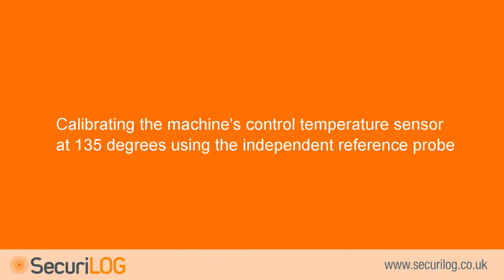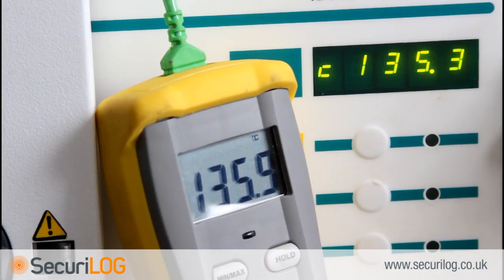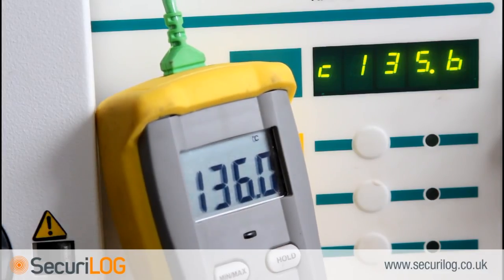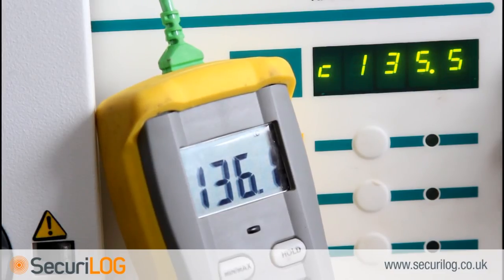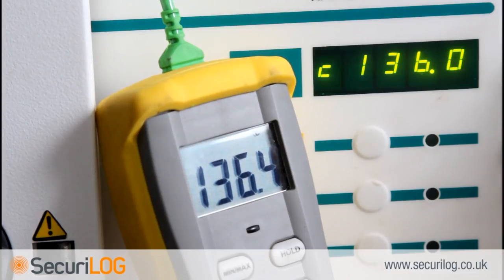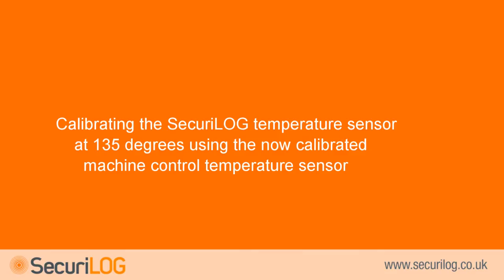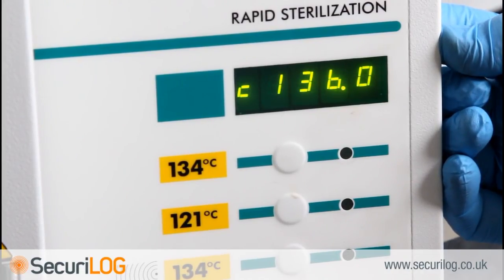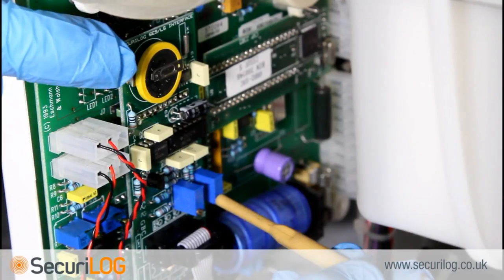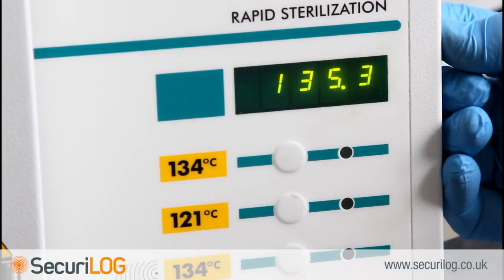Calibrating the machine's control temperature sensor at 135°C with the independent reference probe. The machine will now increase to 135.5°C in order to calibrate the 134°C cycle. There is a time limit of 3 minutes to calibrate the 134°C cycle. Check the steriliser control probe against the independent reference probe by pressing button 5 — the display will again show C, indicating the control probe value. Continue to hold button 5 and, using the trimming tool, calibrate pot R14 on the main board until the control probe value matches the independent reference probe. Then calibrate the Secure log probe at 134°C: switch between the control and Secure log probe values by pressing button 5, and use the trimming tool to calibrate pot R6 so that the Secure log probe reads the same as the control probe.